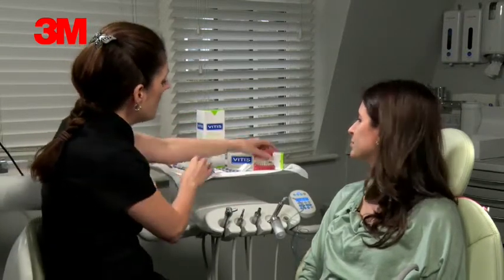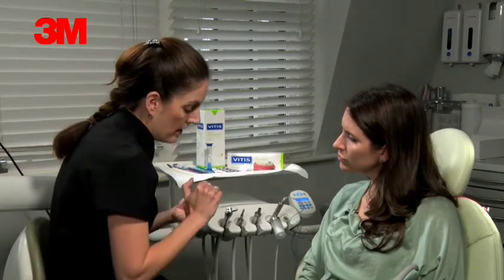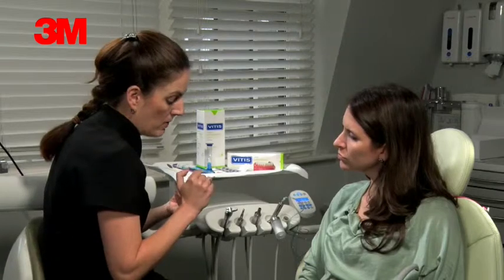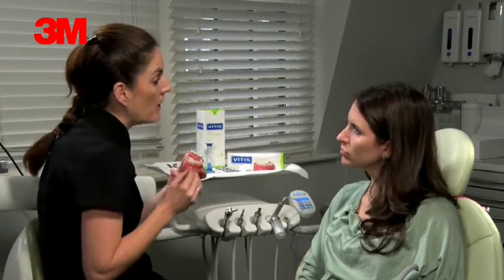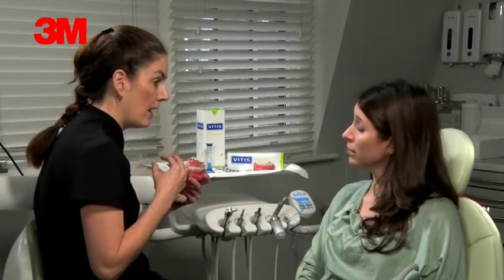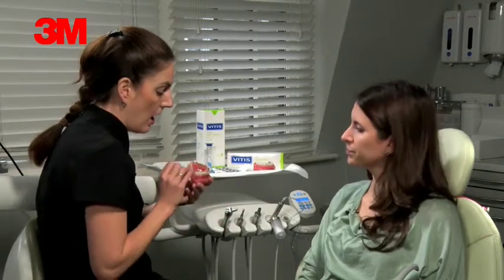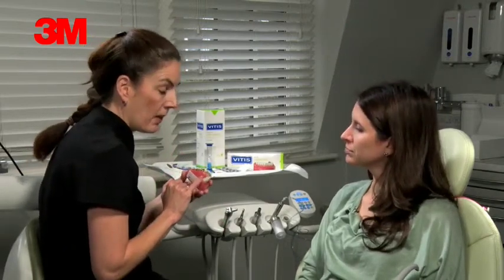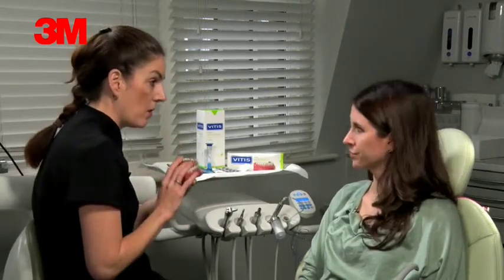If anything does come off the brace — it does happen, sometimes you might bite into something hard and one of these brackets comes off. Normally it stays on the wire, but if it does come detached from the wire, just keep hold of it and bring it back with you because we can re-cement it. Otherwise we have to get it specially made again. If you find there's a wire sticking out the back, just give us a phone call — the teeth move and you get a little bit of excess wire at the back.